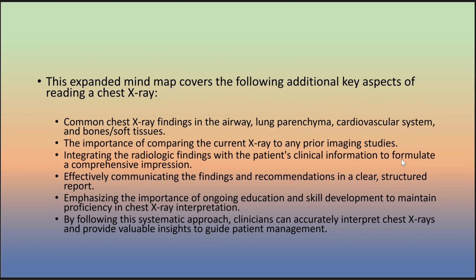common chest X-ray findings regarding the airway, lung parenchyma, cardiovascular system, and bones and soft tissue. The importance of comparing the current chest X-ray to prior imaging studies, integrating radiologic findings with other patient clinical information to formulate a comprehensive impression, effectively communicating the findings and recommendations in a clear, structured report, emphasizing the importance of ongoing education and skill development to maintain proficiency in chest X-ray interpretation.